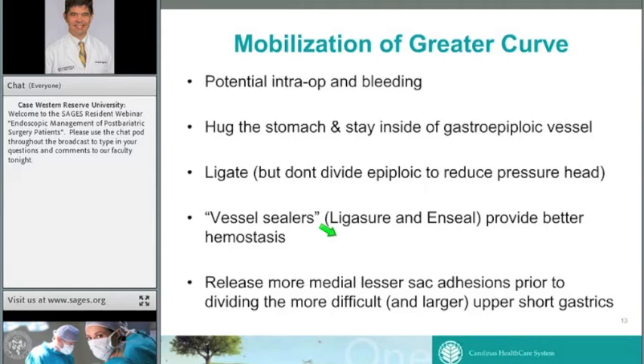The next step is mobilization of the greater curve. If not done correctly, you can have significant bleeding — either from injury to the spleen or, more commonly, retraction of vessels if not properly sealed, which can be very difficult to control once they retract toward the spleen. A key pearl: unlike a Nissen where the stomach stays in, with a sleeve you can burn the stomach along most of the greater curve because that stomach is coming out. We hug the stomach, with good strong lateral retraction, staying in the plane between the stomach and the gastroepiploic vessels. I often ligate the gastroepiploic vessel and have switched from harmonic scalpel to vessel sealers — either LigaSure or Enseal — for better hemostasis on larger short gastrics.